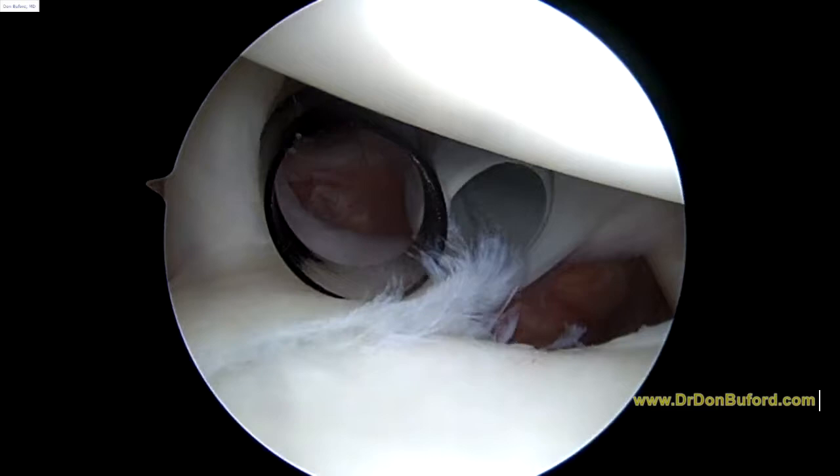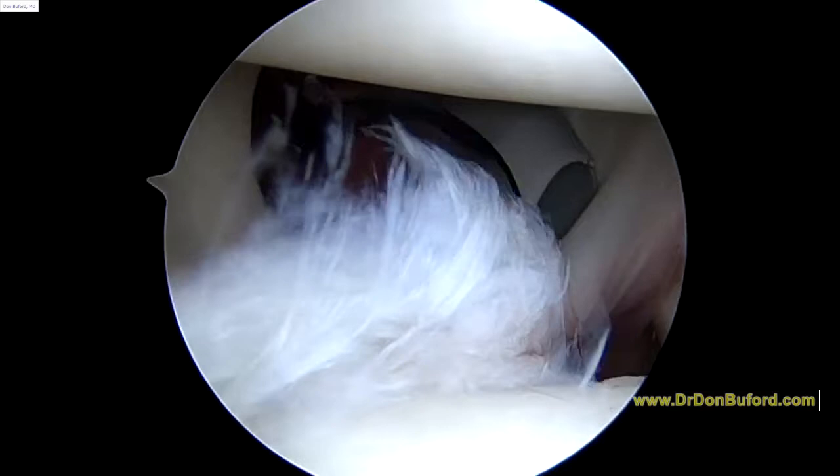Hi John, it's Dr. B here with Dr. Moore. We're just getting started on the right shoulder, looking from the back to the front. Everything that you see is magnified 30 or 40 times on the screen.